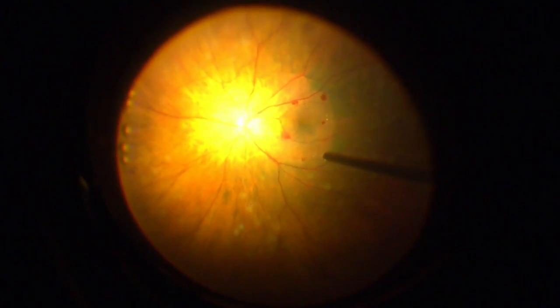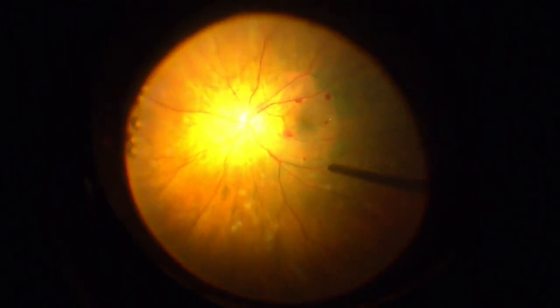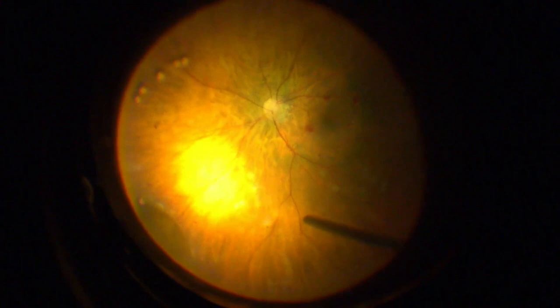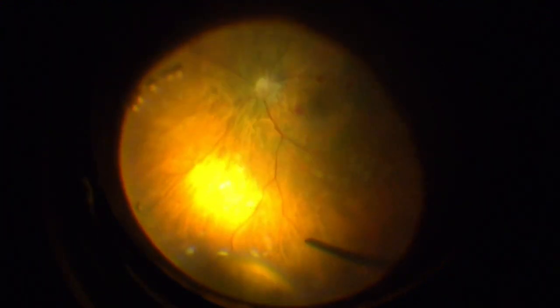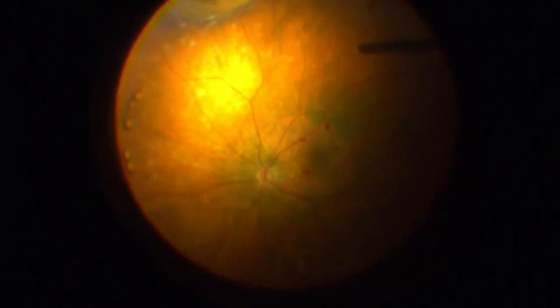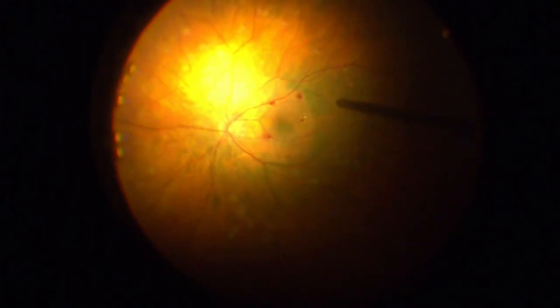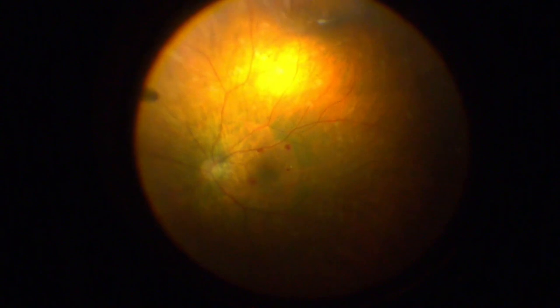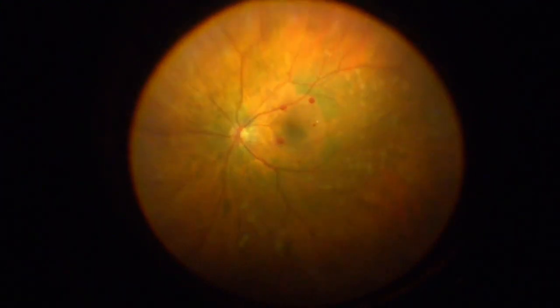Take a look now with our scleral depressor. She dropped the pressure in the eye, the infusion a little bit, so I can depress a little easier. Again, never a bad idea to check the peripheral retina under scleral depression at the conclusion of the case, to avoid post-op retinal tearing and detachment. And in this particular case, certainly when you peel the vitreous, those are the cases where you're going to tear the retina iatrogenically. So always a good idea to get a good look when you're pulling up the posterior hyaloid. Very good. So we had a nice case there.